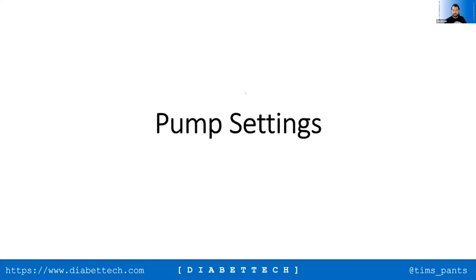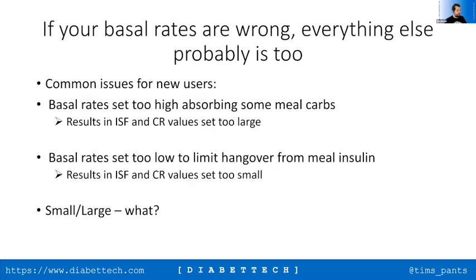So taking the first, I think we just jumped to pump settings. One of the first things that we will always say about pump settings is, if your basal rates are wrong, everything else probably is too. Now, what do I mean by that?